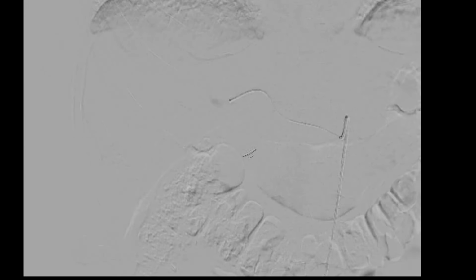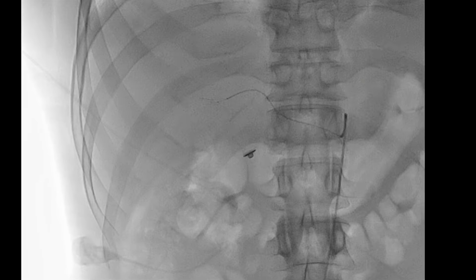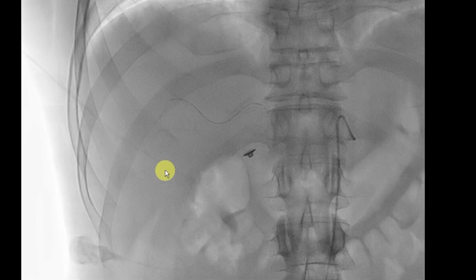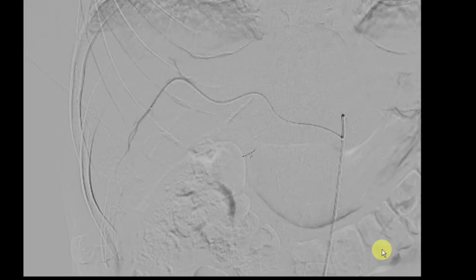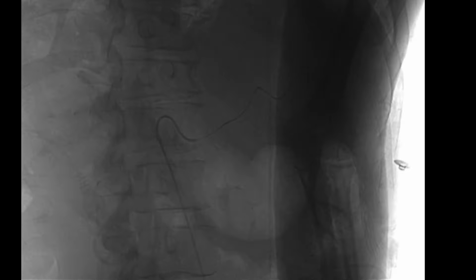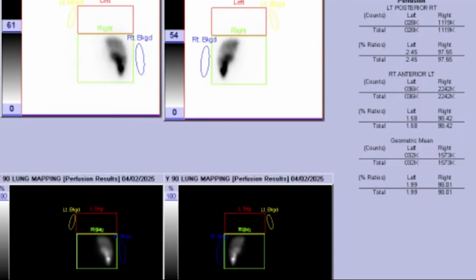But in this case, we also needed to treat the segment 5. And the segment 5 is this branch that is going all the way over here. So we advance our microcatheter in this branch, as you can see. And we confirm the microcatheter position in this branch to the segment 5. We then do a cone beam CT again to do a 3D volume image and to calculate the volumes like we did before.